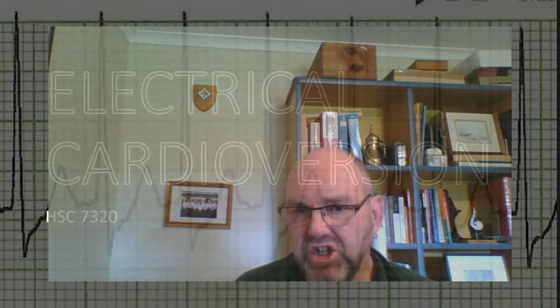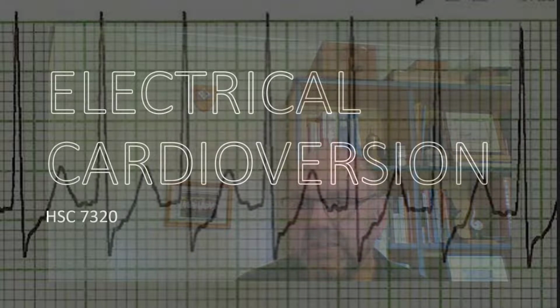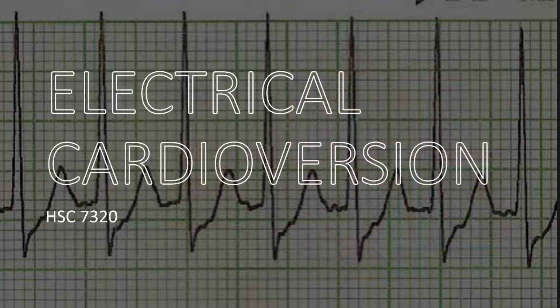Kia ora. Electrical cardioversion is the use of an electrical current to revert a dysrhythmic tachycardia. This type of cardioversion is used in severely compromised patients, irrespective of the genesis of the tachyarrhythmia. That is to say, it is equally applicable for severely compromised patients who have any of the following rhythms: a ventricular tachycardia, a supraventricular tachycardia, atrial fibrillation, atrial flutter, and Wolff-Parkinson-White.